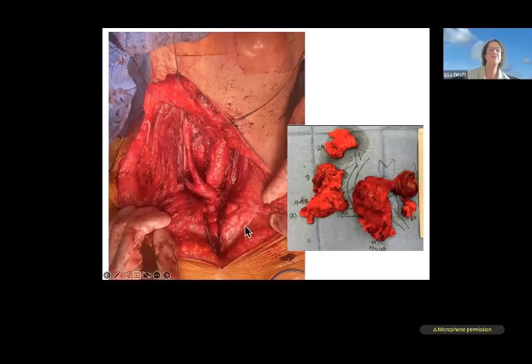And I present this case just to show the right level 6 compartment. I don't know if you can see my arrow, but the carotid artery and into the innominate artery with the subclavian artery coming off here. This compartment really was filled with tumor and adherent lymph nodes. And this is what we would like to address in the central neck on the right, all the way down to the prevertebral fascia and what little portion of the esophagus is visible on the right side.